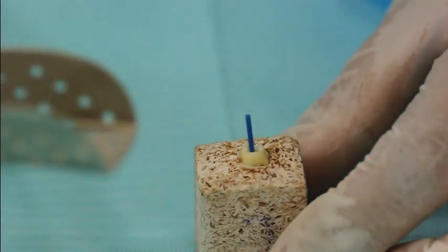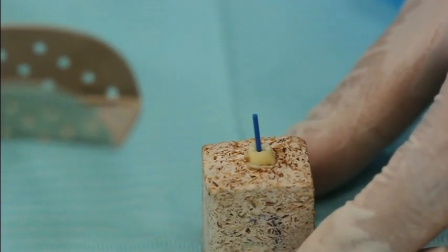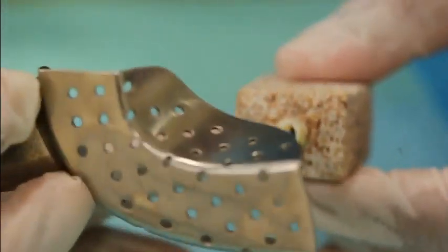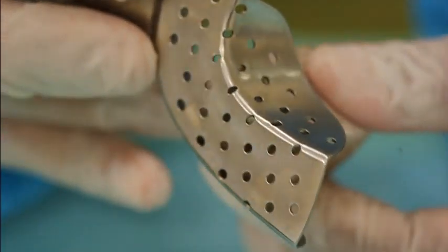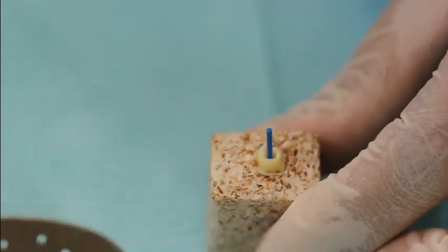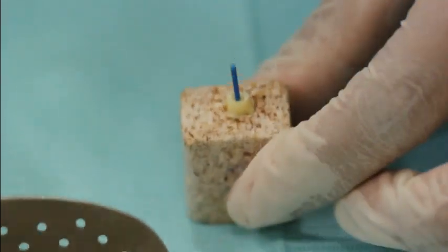In the clinic, you have to fabricate a special tray to take the impression for crown or bridges. So you have to check whether the post interferes with the tray. If it interferes, you have to remove a little bit. In this case, it actually interferes with the tray, so I will remove about 5 mm.